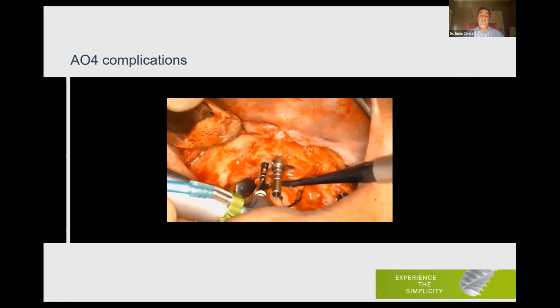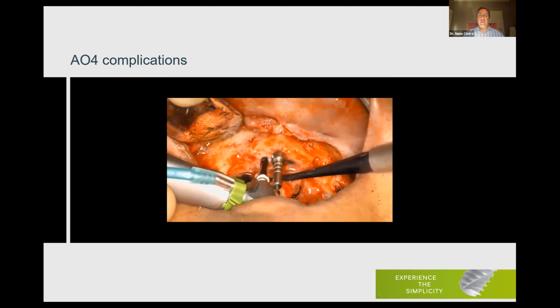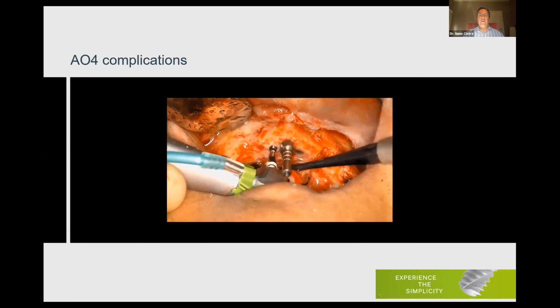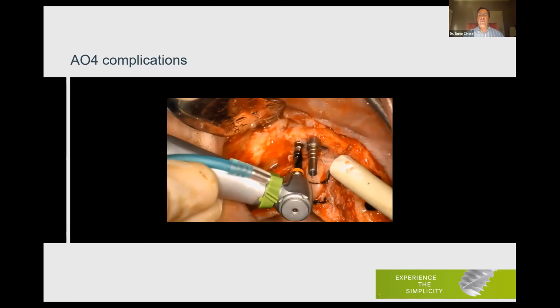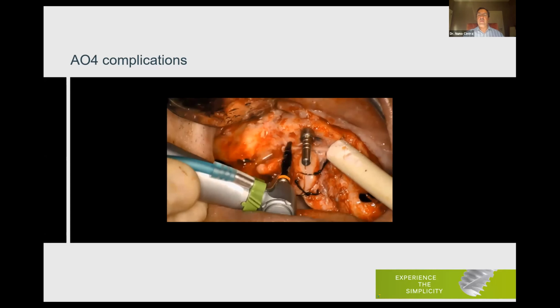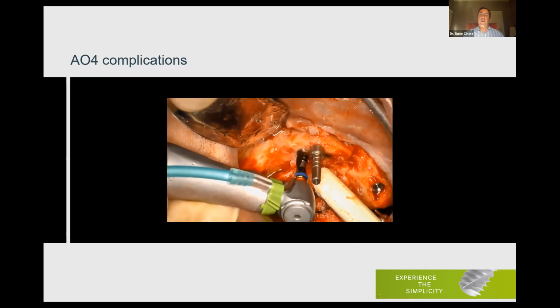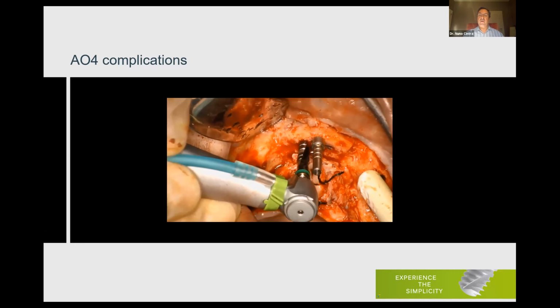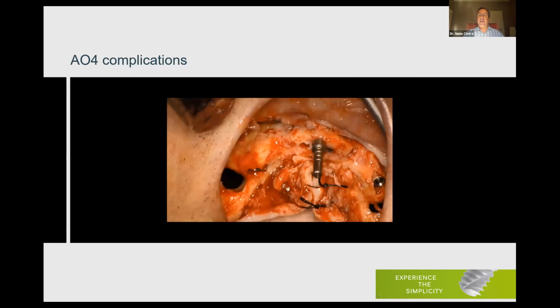This is, for me, the best and the only way to see and to feel what kind of bone we are dealing with. If it's hard, if it's soft. You can do the amount of tests that you want. The 2 millimeter drill is the best way to feel and to see the quality of bone that we are dealing with. As I said before, the drills in this system are step drills, meaning that the tip of the drill is the same diameter as the previous one. So it's very easy to place the drills in the right position. So we will keep the parallelism of the preparation by using these step drills.